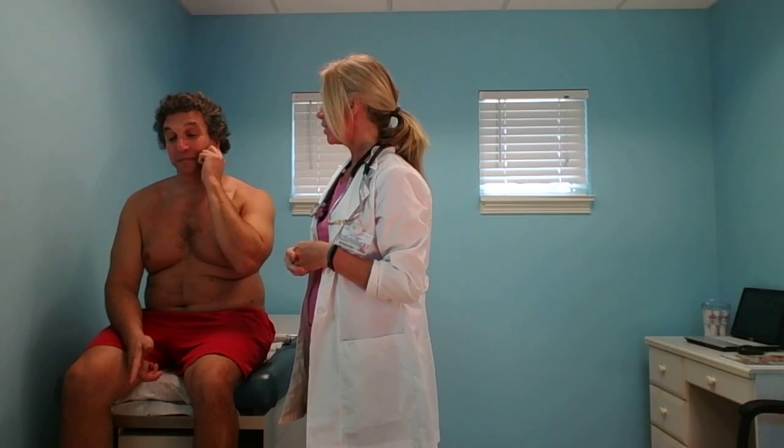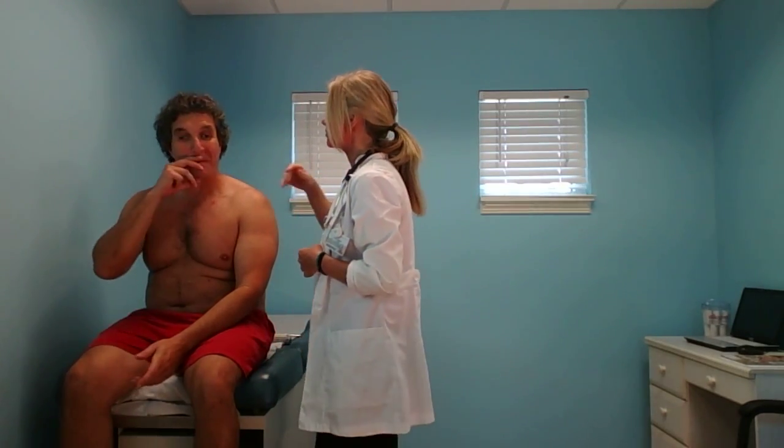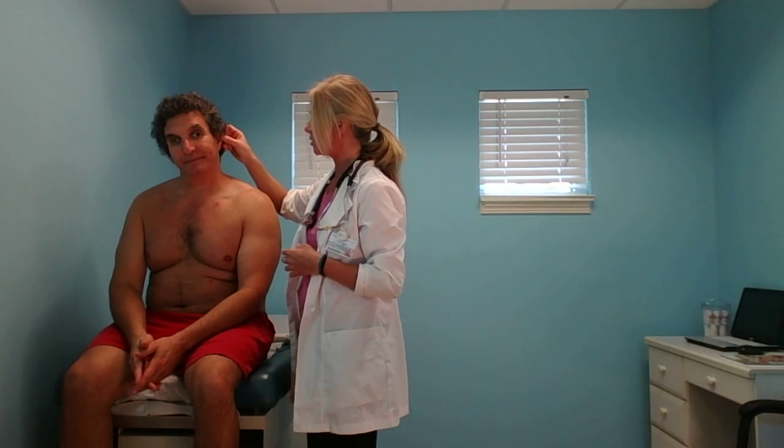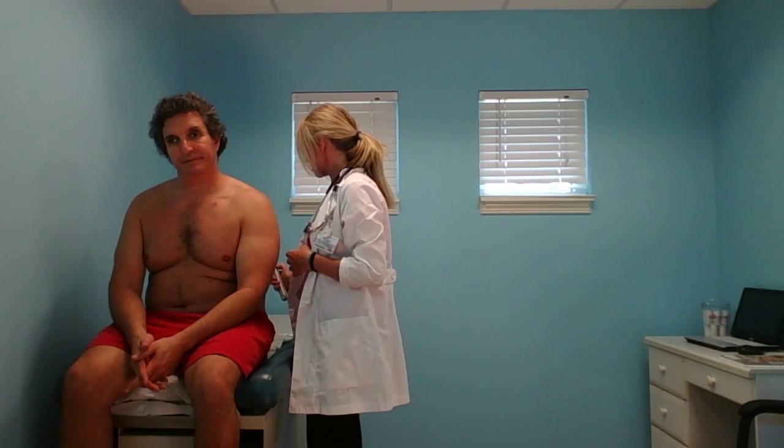So from here, we're going to go on to the ears. And I'm going to, again, assess the symmetry of the ears and the alignment of the ears. Check the auricle. And that's all good. We're going to go ahead and look inside Don's ears.